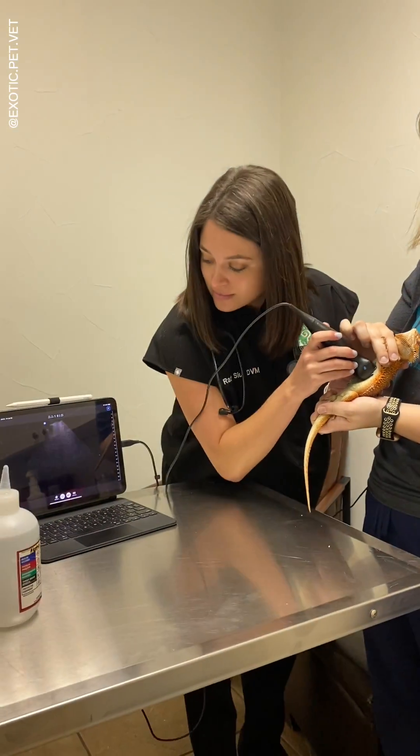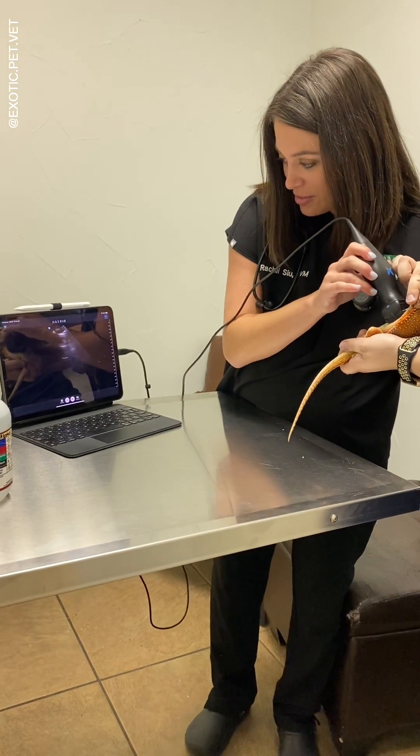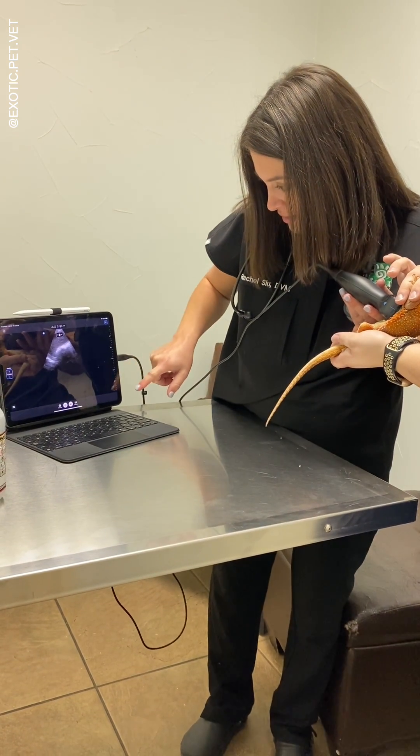It has many different presets that you can select depending on what depth and what body part you're scanning, and the focal zone and frequency will adjust automatically. It's super easy to use, and you can adjust the depth and brightness just by swiping on your phone or tablet screen.